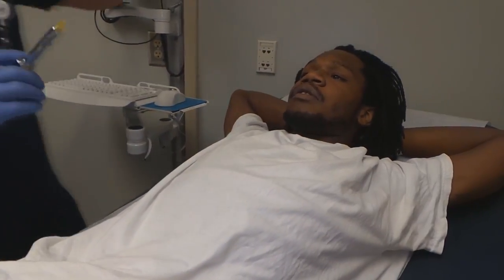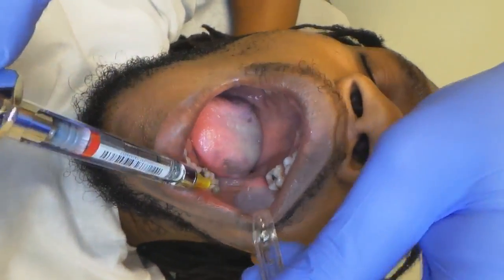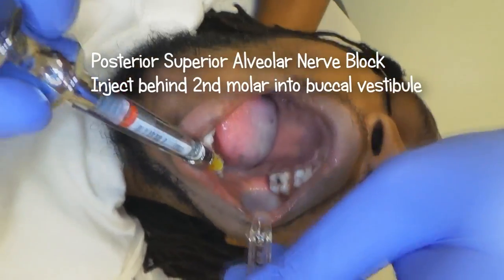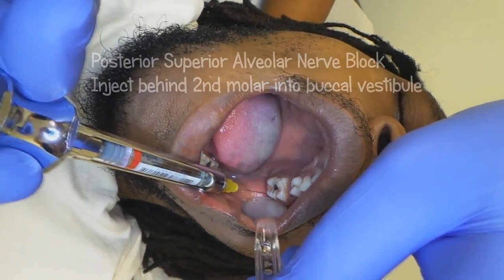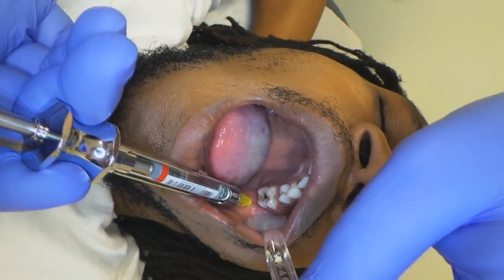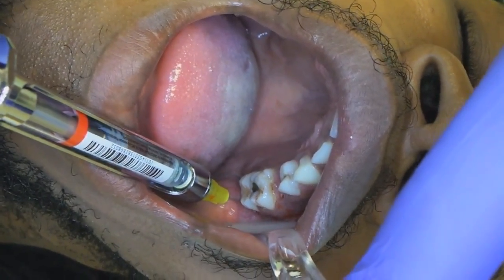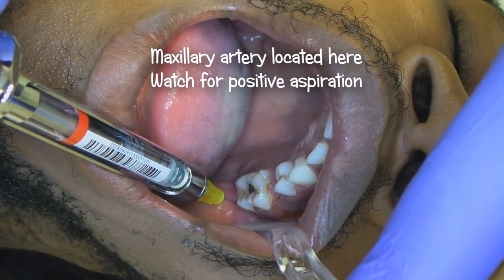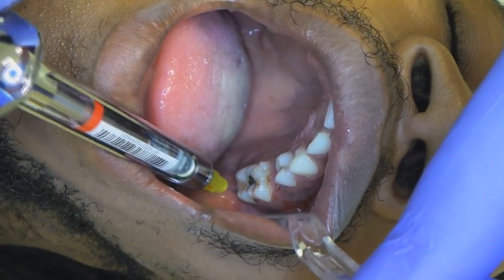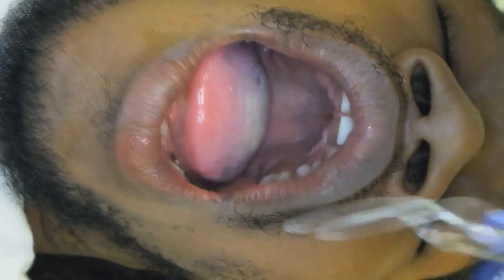So this is the PSA — you've got to get a little bit further back. He's really swollen so it's hard to push the cheek out. The landmark is just posterior to the second molar in the buccal vestibule. The maxillary artery runs right through here, so most of the time you do get a positive aspiration. I don't really follow the book — they always say use half a carpule or quarter carpule, but I always use the whole thing. The toxicity of lidocaine is so minimal that I always give a carpule every time I infiltrate.